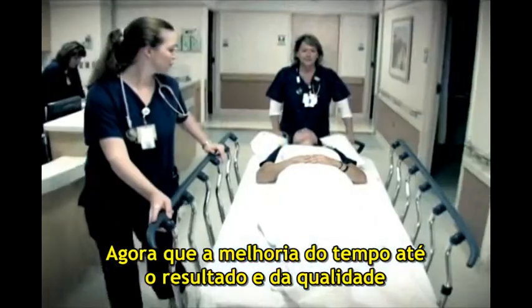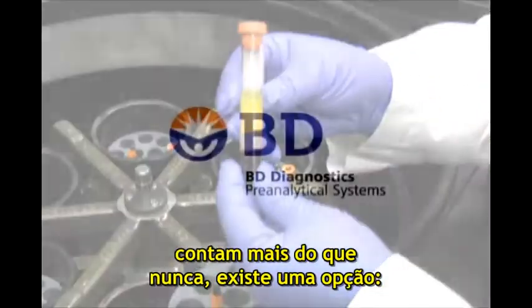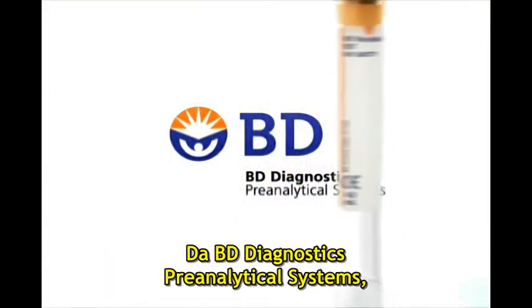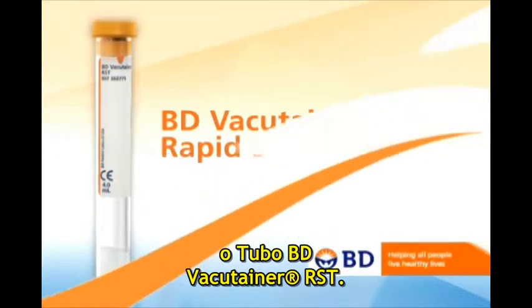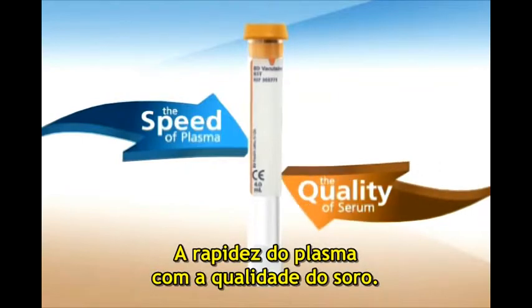Now, when improving turnaround times and quality count more than ever, there is a choice. From BD Diagnostics Pre-Analytical Systems — the BD VacuTainer Rapid Serum Tube. The speed of plasma with the quality of serum.